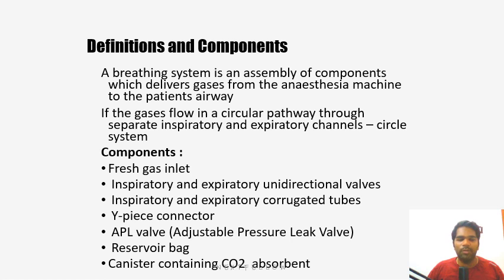And there is a reservoir bag. The function of the reservoir bag is to give positive pressure ventilation and to get the excess gas that is present in the system. And finally, a canister contains CO2 absorbent. The soda lime canister we will see in a separate slide, separate class. Now these are all the components. You just remember the components.